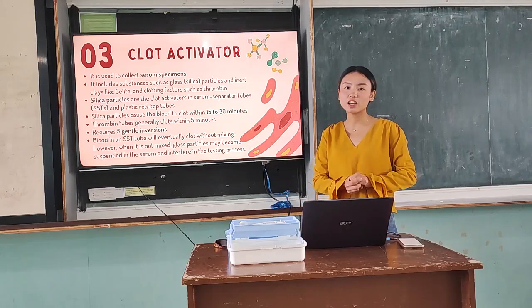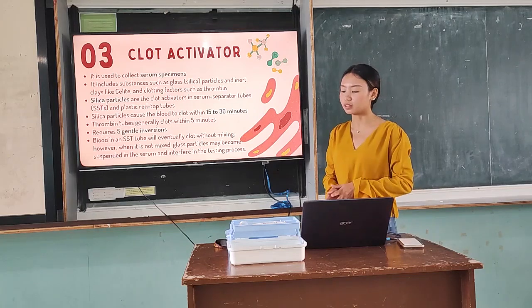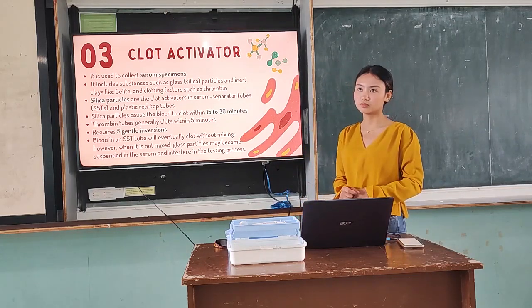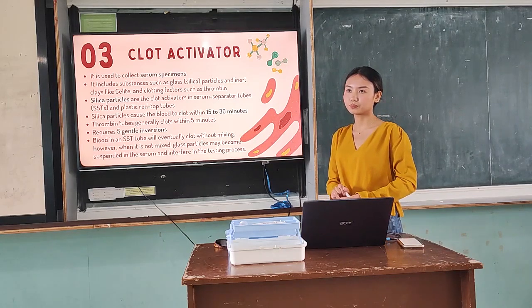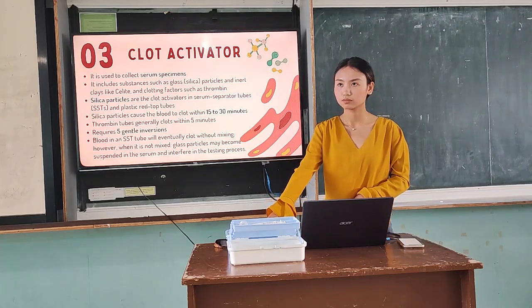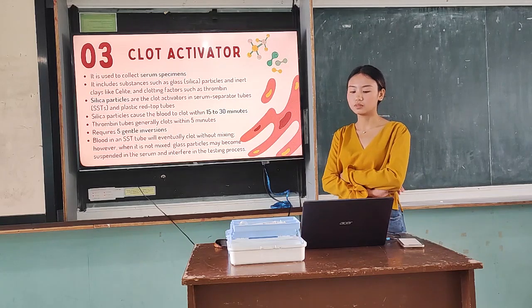Can someone here differentiate yung glass and plastic red top natin? Ma'am, sa pagkakaalam ko po kasi ang clot activator, yung red top tube ay meron siyang dalawang types, the plastic one and the glass one.